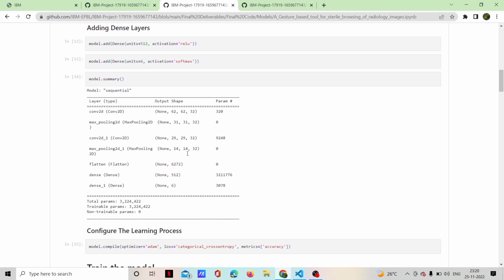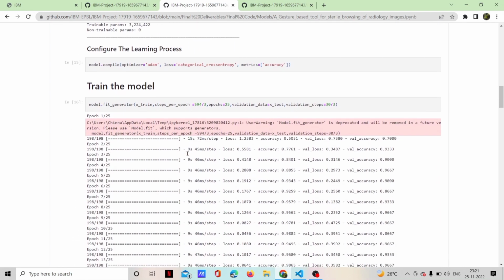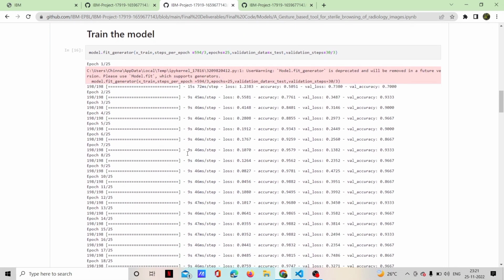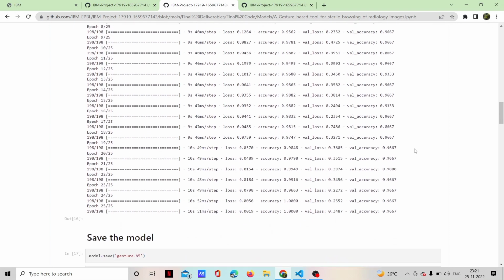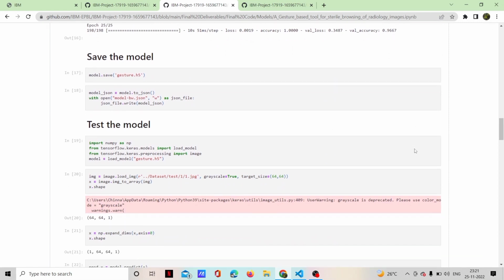Then we train our model using epochs. An epoch is the number of iterations for training the data in one particular cycle. We trained our model for 25 epochs. Then we save the model. The model is saved as gesture.h5 and a JSON file which is called model-bw.